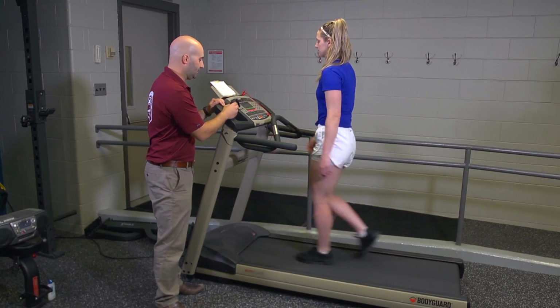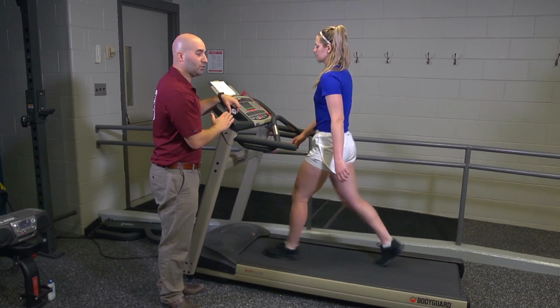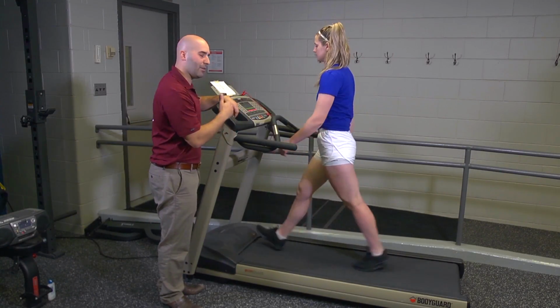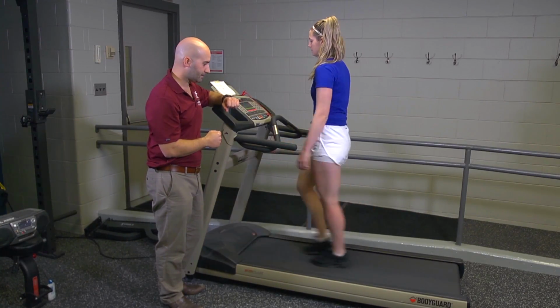So here we see that the watch has the heart rate, and the treadmill's also picked it up as well. And so I'm aiming for 120 to 150. And you'll see it might take a couple of minutes for that heart rate to ramp up to the appropriate workload.